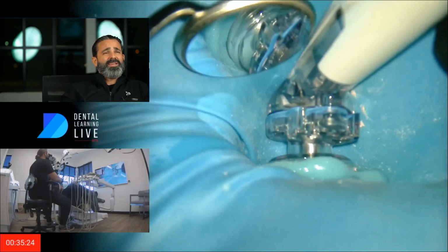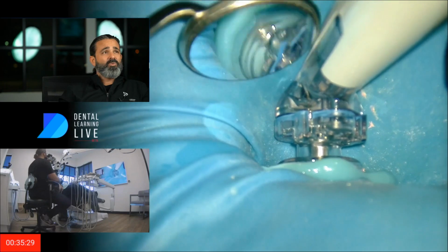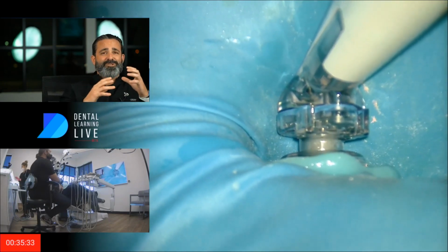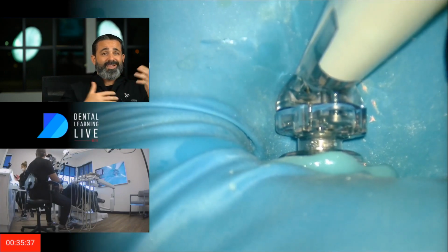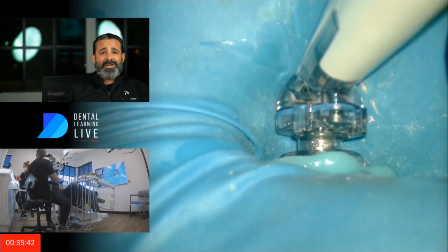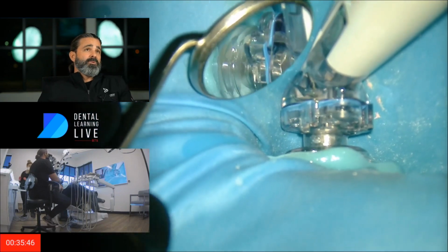I remember in dental school days when we were waxing teeth, you know, I would try to build a tooth up just perfect. And it took me a lot longer to build up than just whittle it down. Overbuild and whittle down was a lot easier at the end of the day. And that's kind of my mentality with Sound Seal. Overbuild, whittle it down, or reapply if there's a bubble.